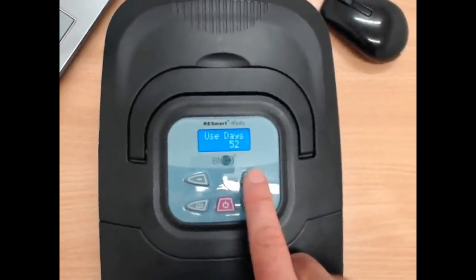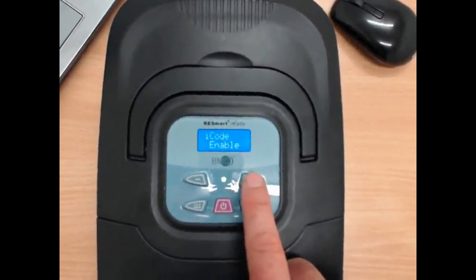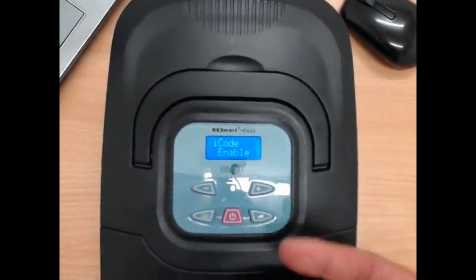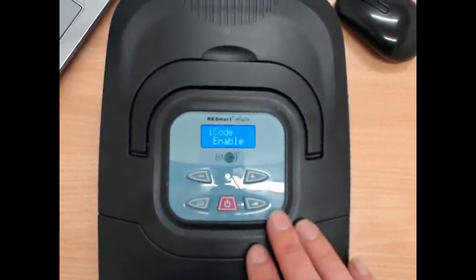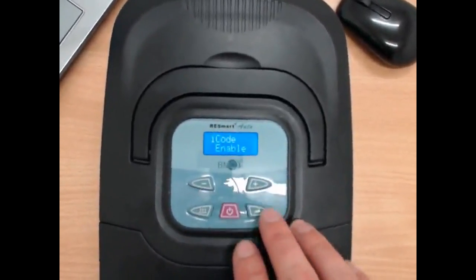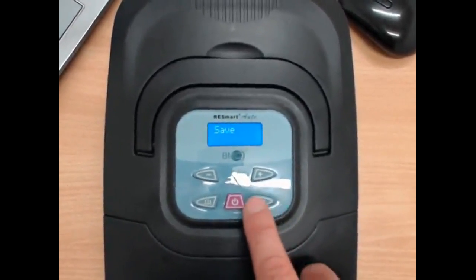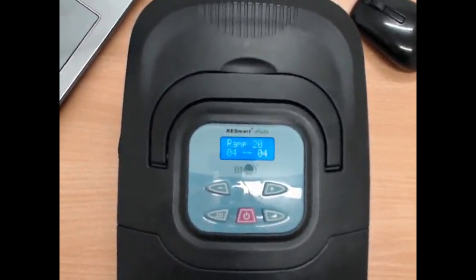Then you've got the date, how many days it's been used. You want to have this as iCode enabled because that means that the machine's going to store your iCodes, which is your data. So we want that enabled. Okay. And then we get to the end and it says save, and we just click this button down and that now saves all the settings.